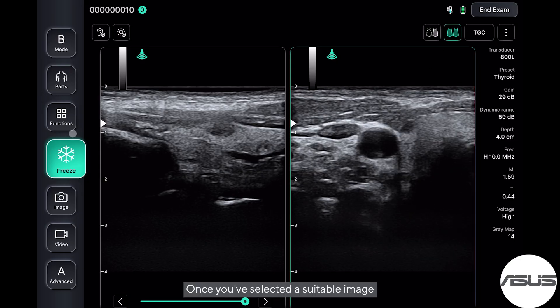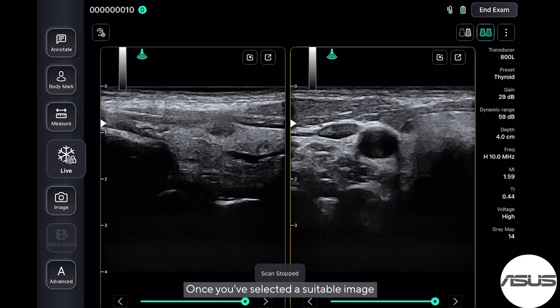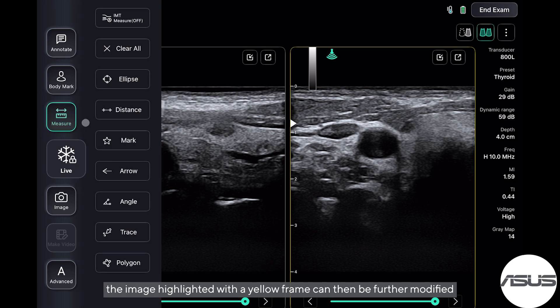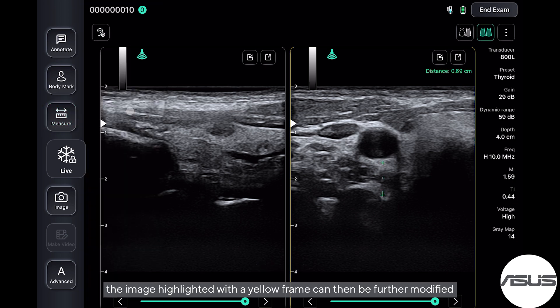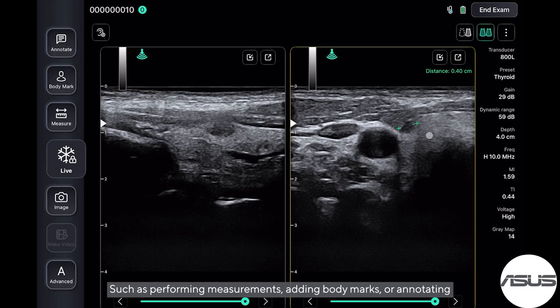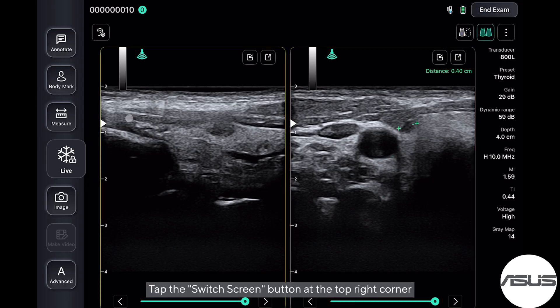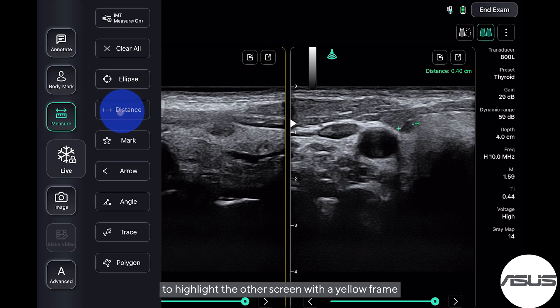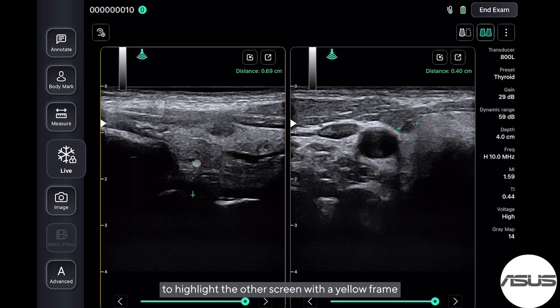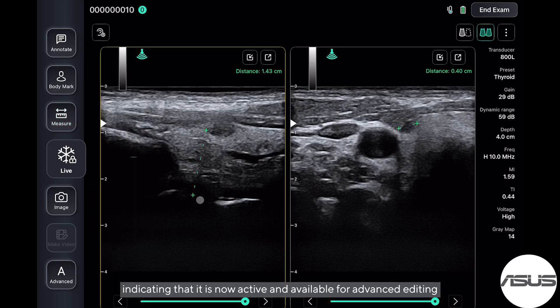Once you've selected a suitable image, tap the freeze button. The image highlighted with the yellow frame can then be further modified, such as performing measurements, adding body marks, or annotating. Tap the switch screen button at the top right corner to highlight the other screen with the yellow frame, indicating that it is now active and available for advanced editing.